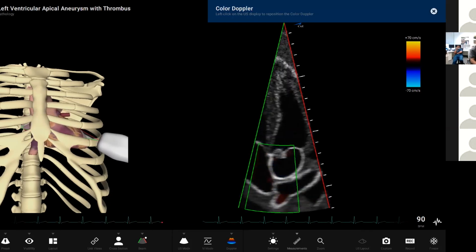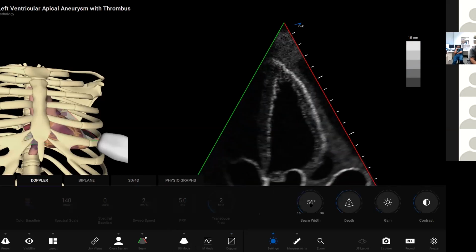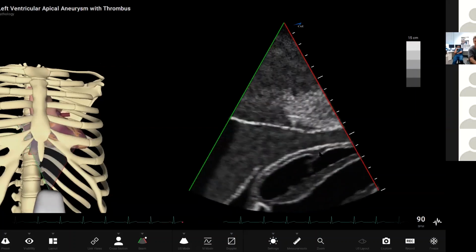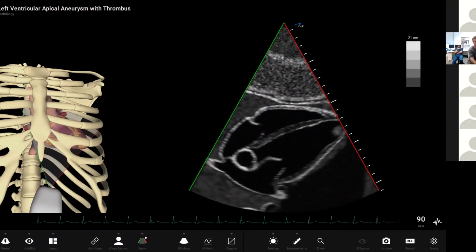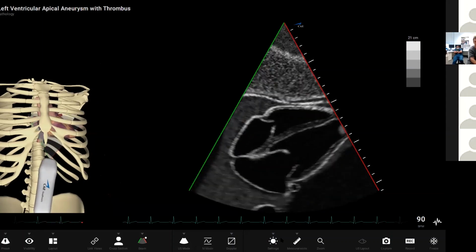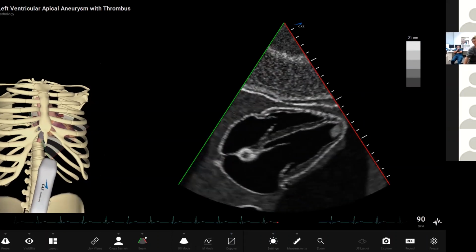Okay, final thing to talk about, and then I'll stop rabbiting on, is the subcostal view. There are some really nice articles coming out in critical care about this. We've got a wonderful sonographer called Jenny who's really good at this. Our standard subcostal view is this, where we use the liver as our imaging window. You can maybe increase the beam width a little bit, and we're trying to have a look at that apical 4-chamber view side on.